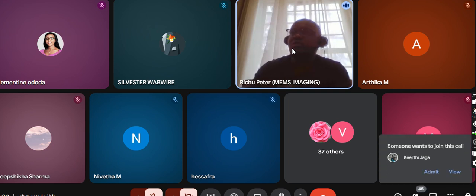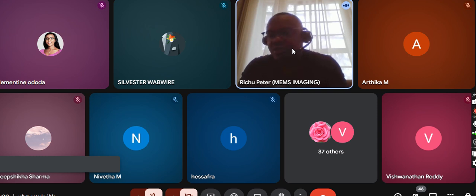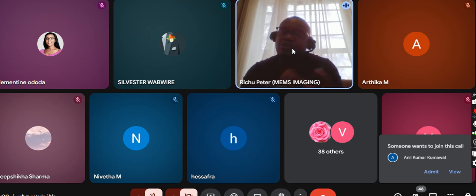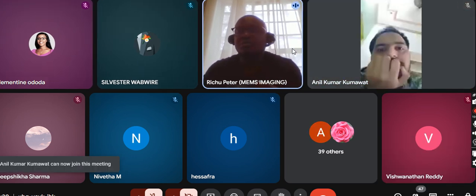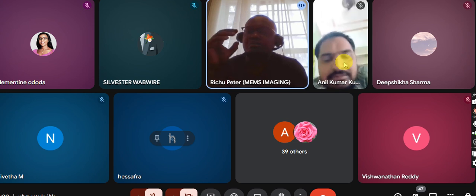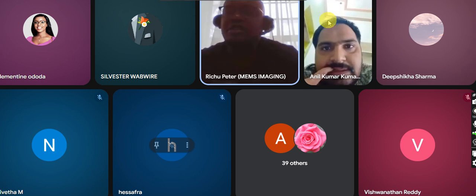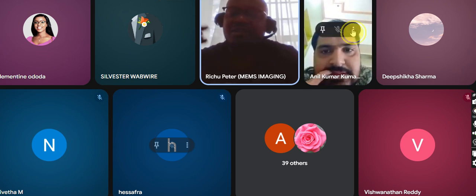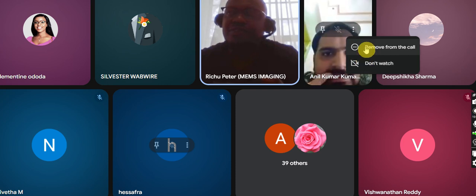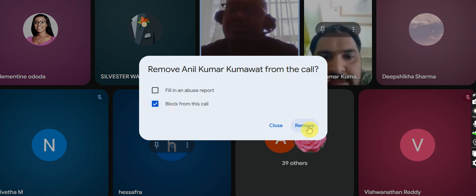What you used to have was a dark room where you develop the images, like a photo studio, and then you moved into CR systems. So you have a cassette, and inside the cassette you have what you call an imaging plate, and the imaging plate is the one that holds the actual data from the examination, and then the imaging plate is actually read by what is called the CR machine to create an image now on the actual X-ray system.